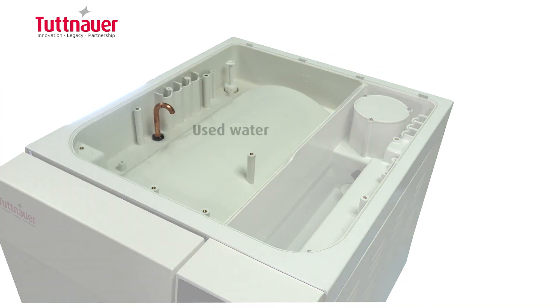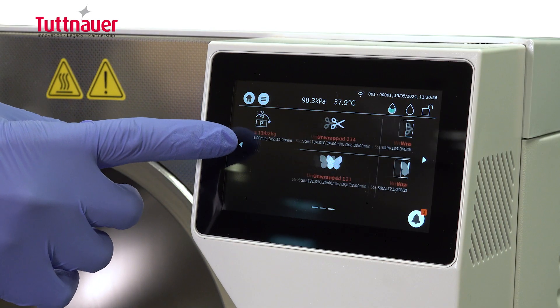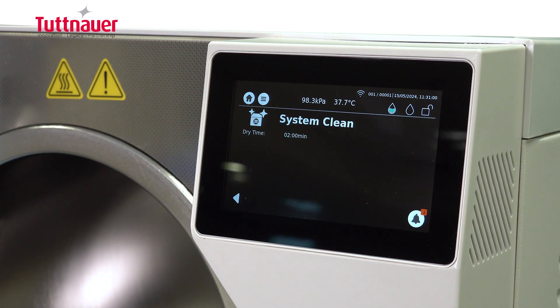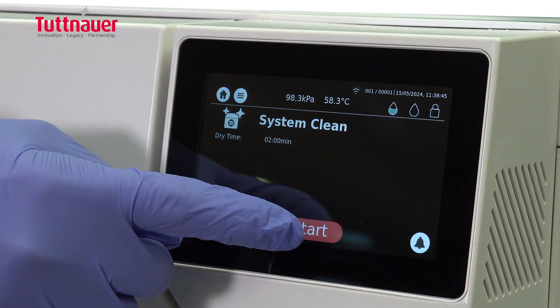The T-Top has two water tanks — one for used water and one for clean water. Water is never reused from one cycle to the next, which eliminates debris built up in the chamber. We recommend running a system clean cycle once every two weeks with the T-System Clean Tablet to ensure proper cleansing and removal of water deposits, oxides, and other sediments in the piping and chamber.